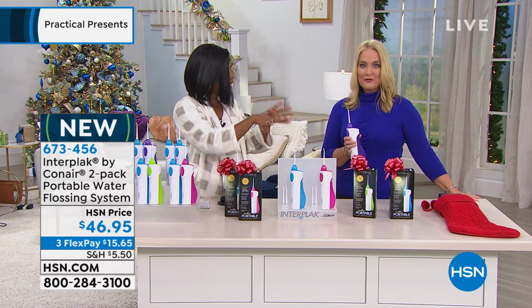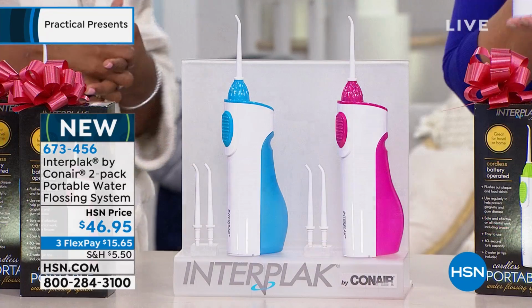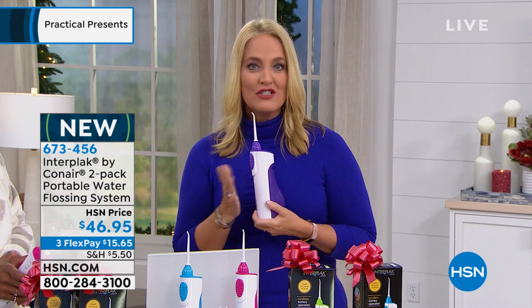You just add water, any hot water, cold water. So what I recommend if you're brand new, there's 2 different levels on this. There's level 1 and level 2. So there's a low and a high. So here's the low. And then here's the high. You can hear that it definitely has a lot more power on the high.